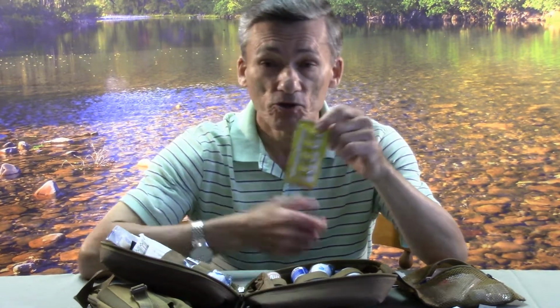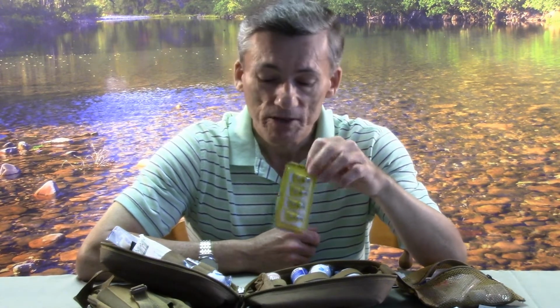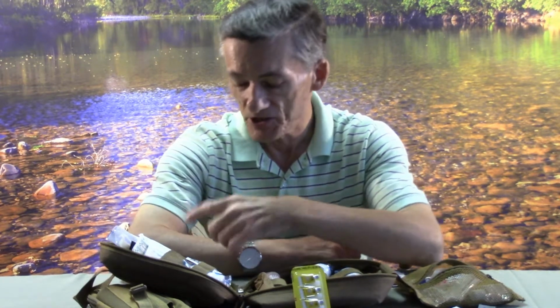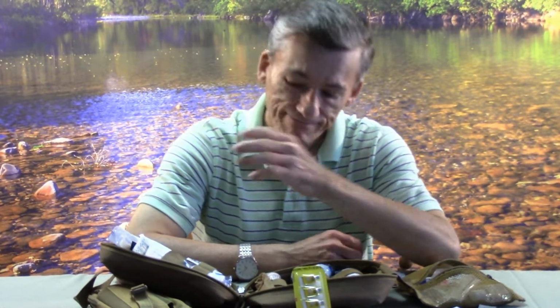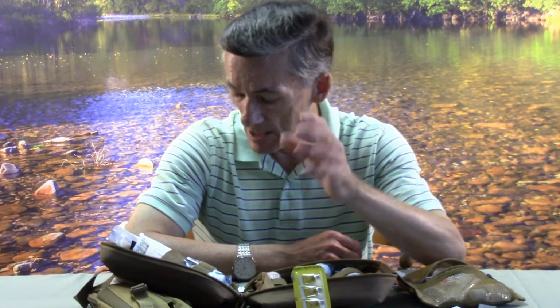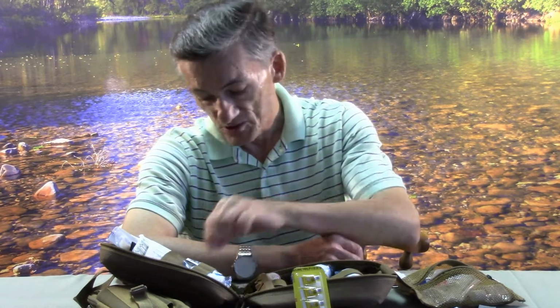And it's not like I use it, I've actually never used it for this, but I know a lot of medics have used super glue to seal up a wound when there's no stitching available, basically better methods for closing up a wound. I wouldn't use this for an extremely traumatic wound, but for a laceration to the point where you might be thinking about stitches, super glue will seal it shut.